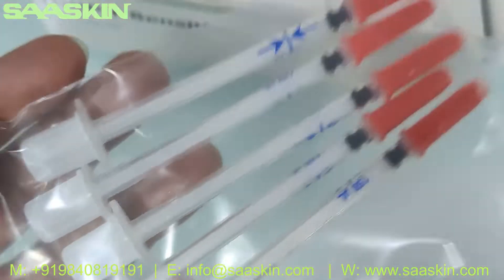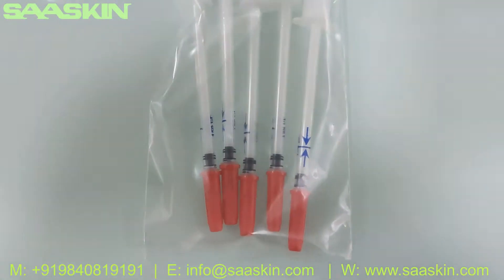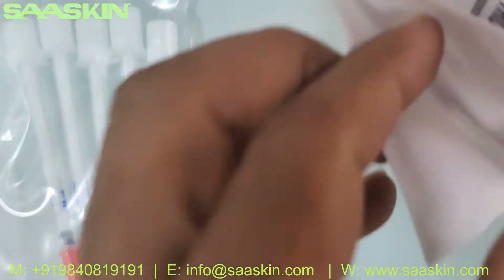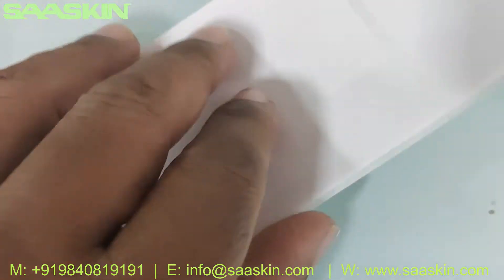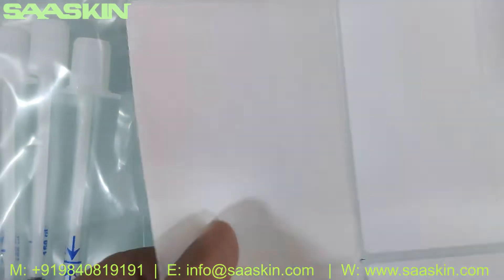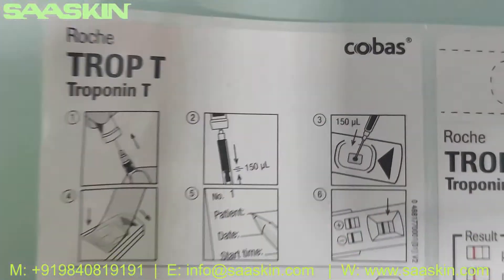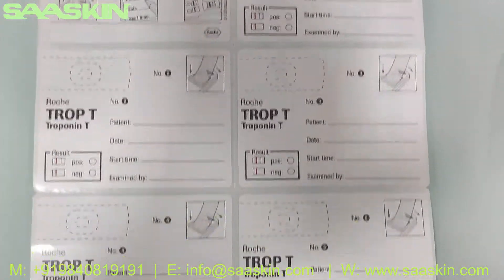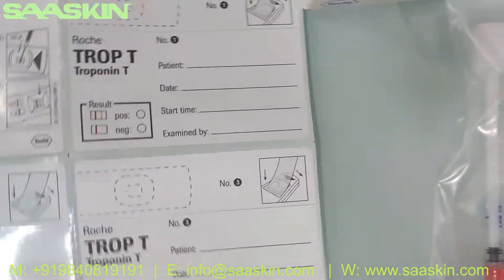You can see there is a set of five pipettes for collection of the blood. You also get patient ID stickers — you get five stickers here for patient identification.